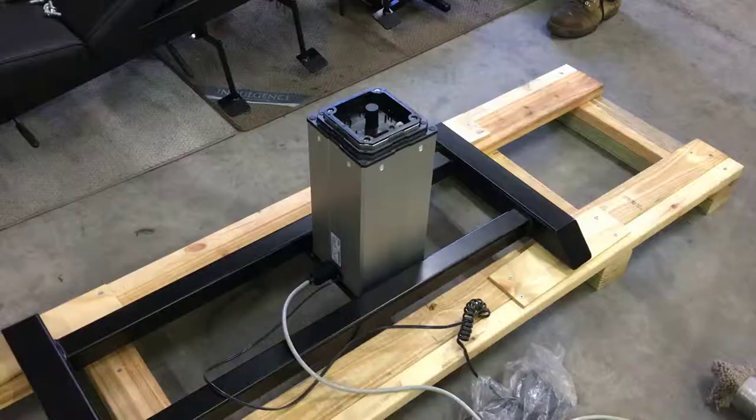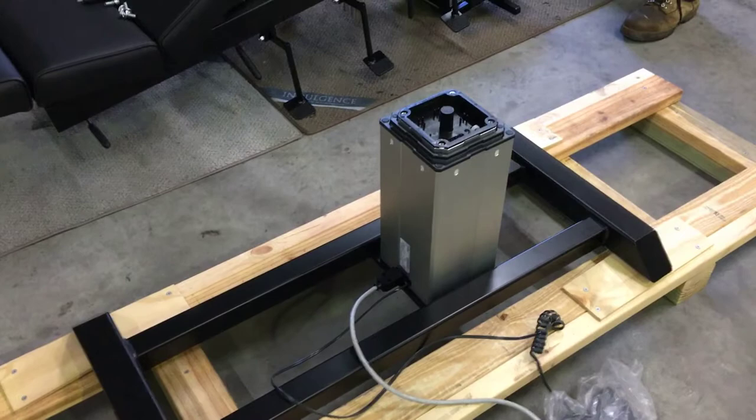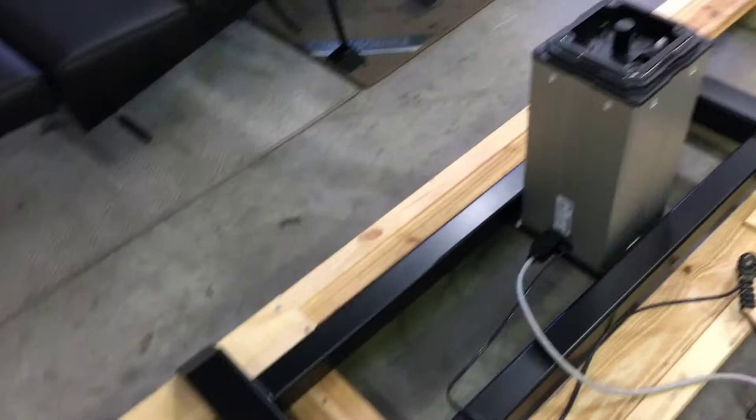Now we're ready to place the top cover back on. We've got this unit mounted and ready. When we place the actuator on, we put the cords to the access at the back of the table, so please make sure you put it on the correct way.